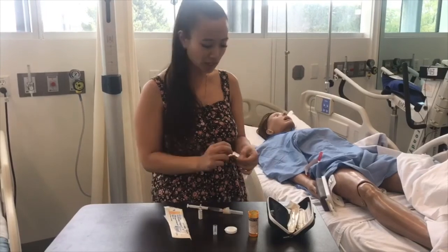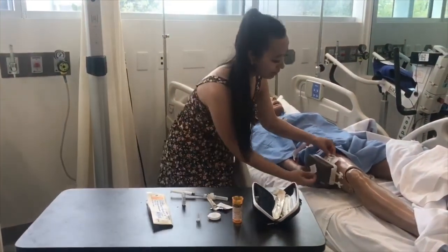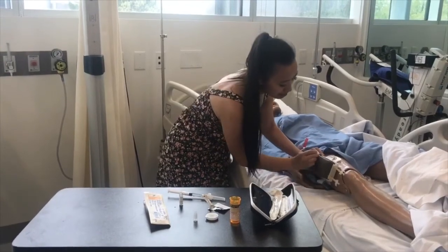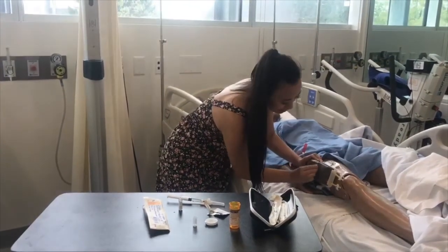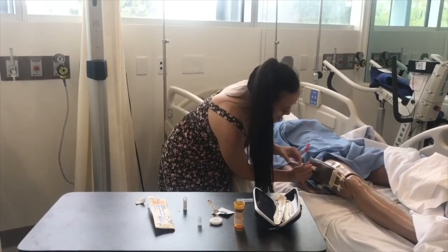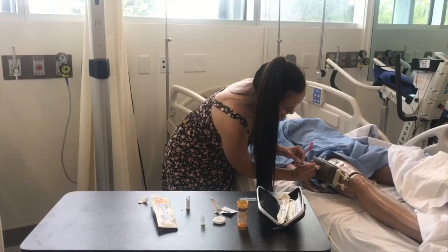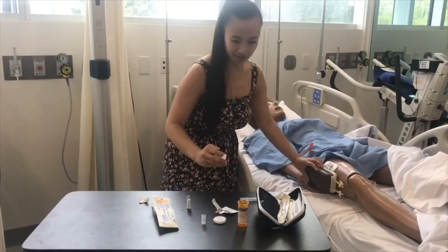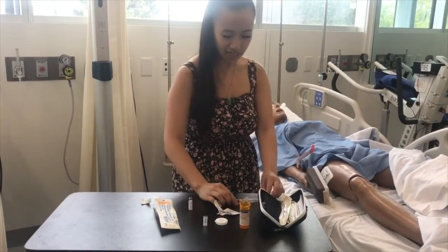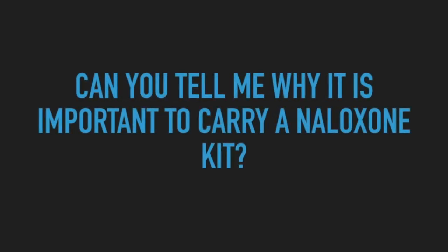I'm going to scrub the patient's outer thigh vigorously, but if they are wearing pants, then we just inject through the clothing. Engage the safety.